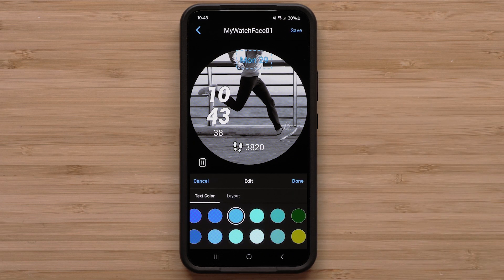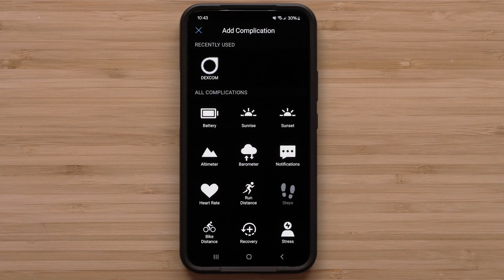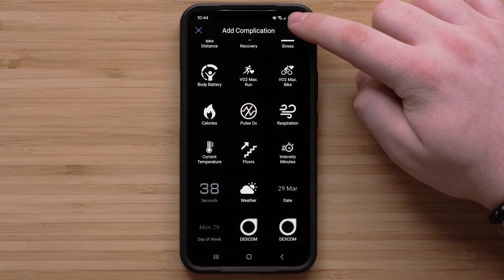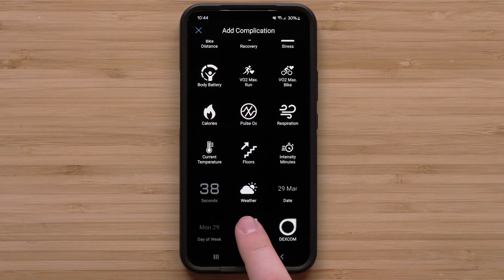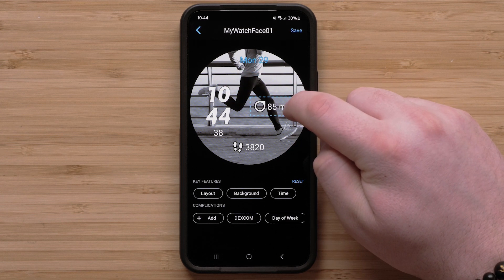Select Done when you are finished customizing that option. You can also add other complication options. Select Add to see a full list of available complications. Scroll through and select one of the Dexcom offerings, then move the complication to the desired location on the watch face.